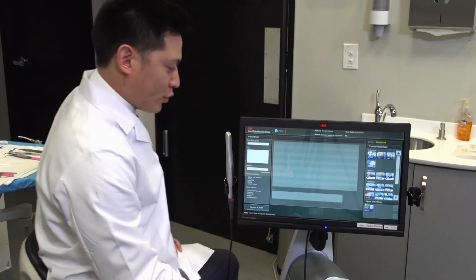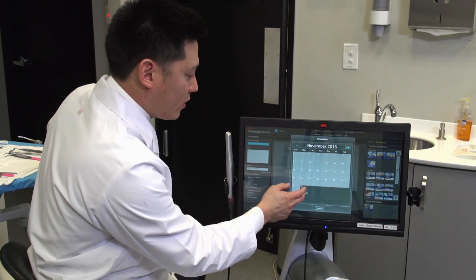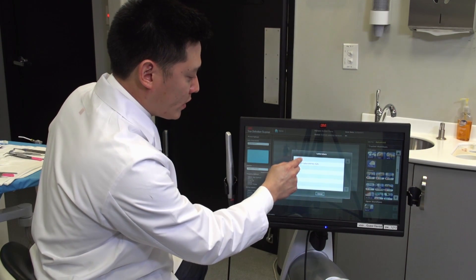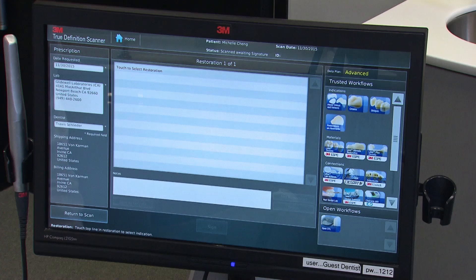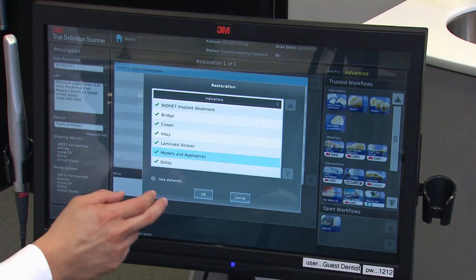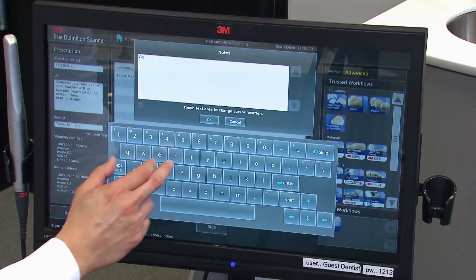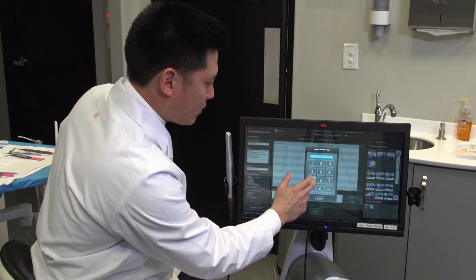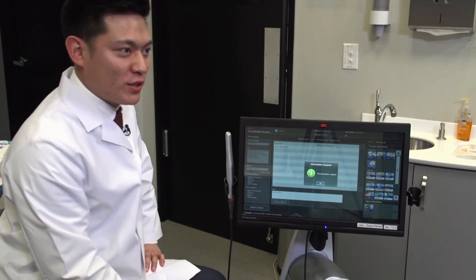On the 3M TrueDef software, we're going to first indicate the date that we would like the restoration or prosthesis back, then indicate the lab. If I were doing a chairside restoration, I'd send to iOS, but in this case I will send directly to Glidewell for the fabrication of the splint. Then I'll choose the type of restoration — for this, I'm going to choose Models and Appliances. Under the notes, I'll add a note that I would like the Astron night guard. The last step is just to sign it, a couple of buttons, and the case will be digitally submitted to the laboratory for fabrication.